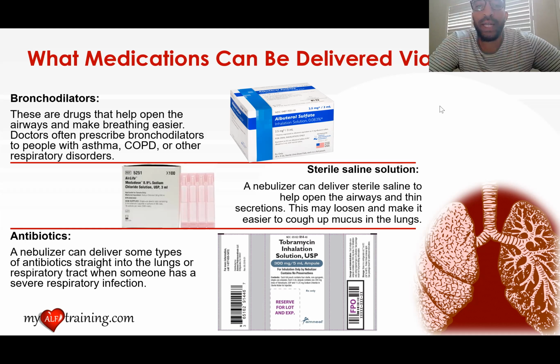And we would go in and administer this medication, saline, which is almost very similar to water. And what it does is just liquefies the mucus and makes it a lot easier for the patient to bring up or easier for us to, in the ICU, go in and suction from the lungs ourselves.